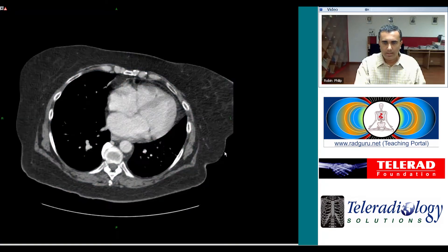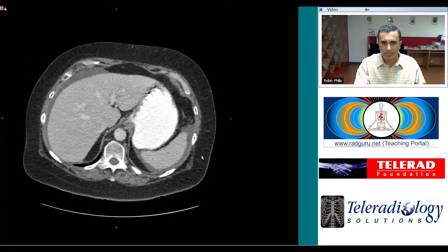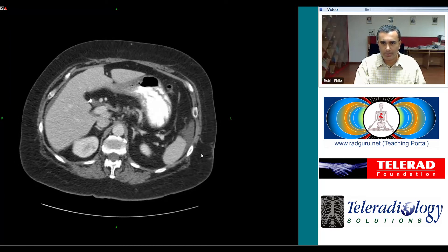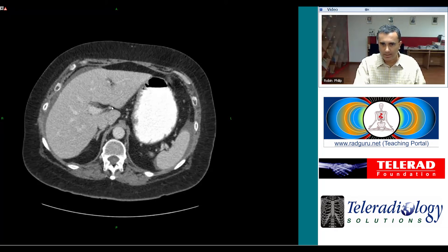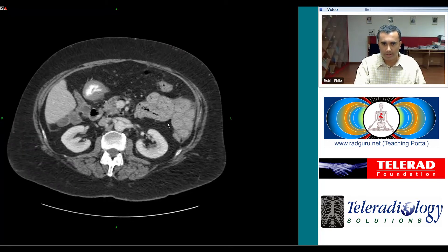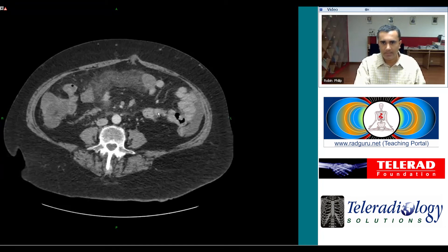Here's an interesting case from the emergency room: a patient presenting with abdominal pain. As we scroll through the abdomen, we start to see just beneath the diaphragm there is free fluid around the liver and the spleen. As we come down, the gallbladder is out; the common bile duct is a little prominent, but that's to be expected in someone who's undergone cholecystectomy.